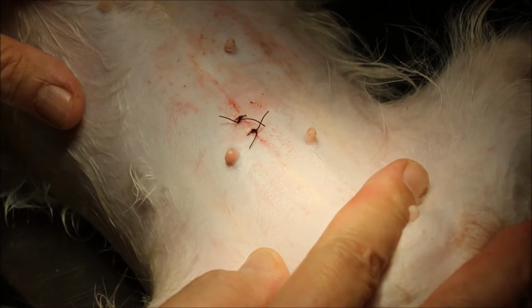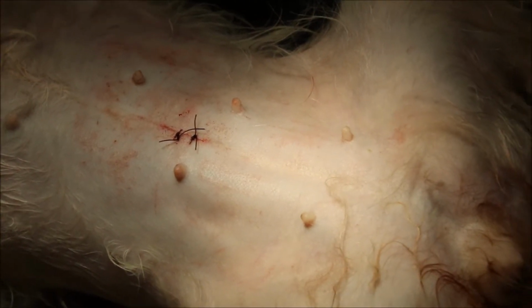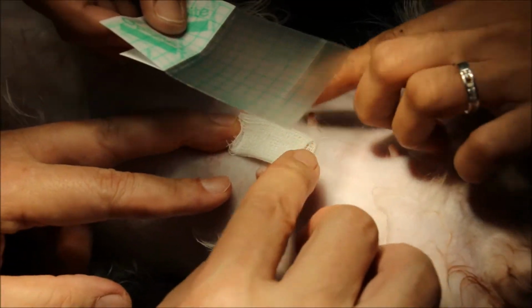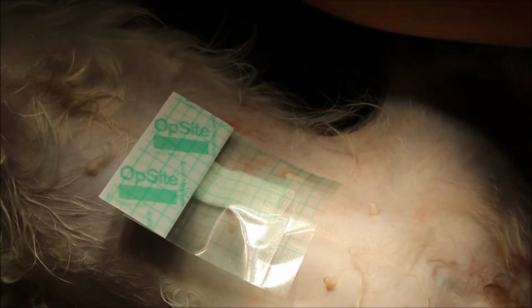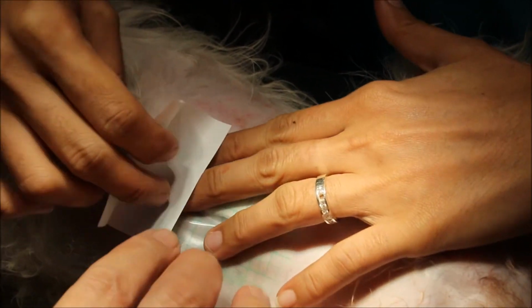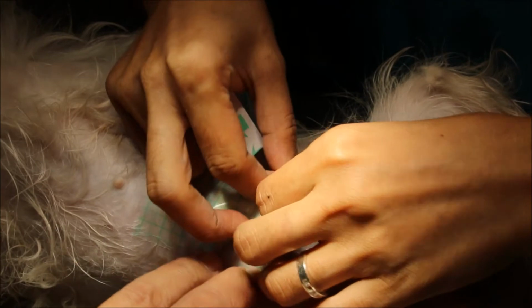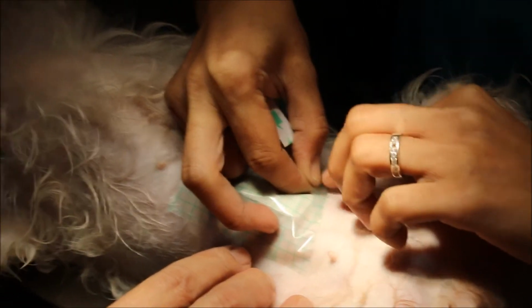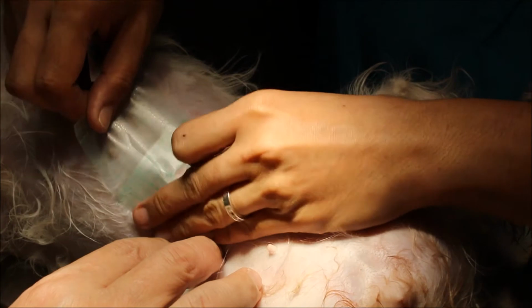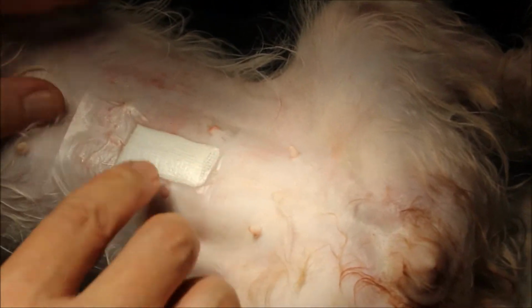Now you can see that there should be no bleeding, and now my assistant will just tape it over. Normally I have a protective plaster so that the dog doesn't lick it, and normally I don't give the collar, especially if it's possible. The only complaint is sometimes the dog is allergic to the plaster. Now this plaster is a bit too big, I would say. Ideally the plaster should not go around the nipples, it should be just a bit longer. But anyway, this is much firmer.